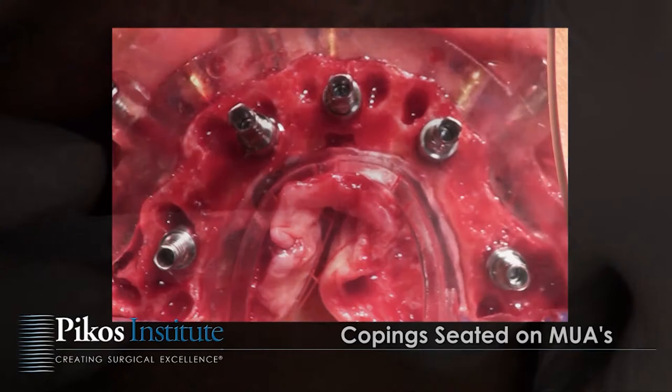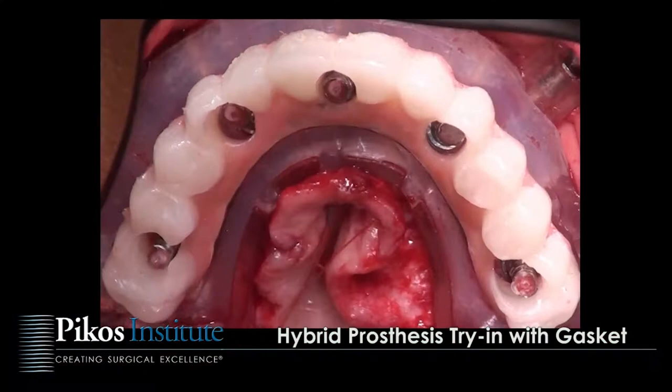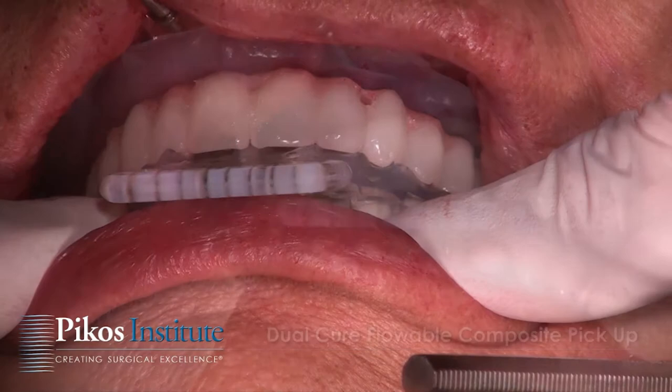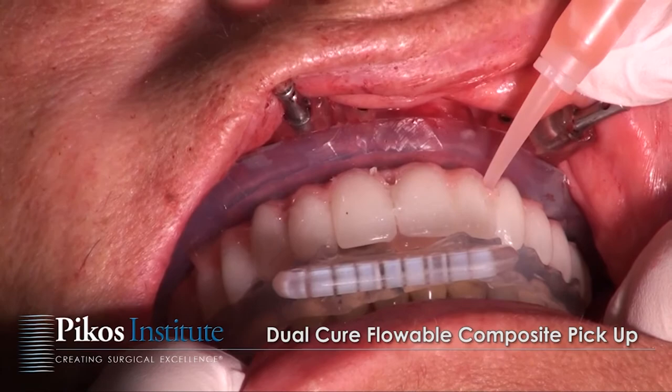As we show the copings in place, there is a gasket that prevents extrusion of any flowable material used to pick up the prosthesis. We're indexing this arch against the opposing arch and using our flowable composite for pickup, done in a very precise manner.